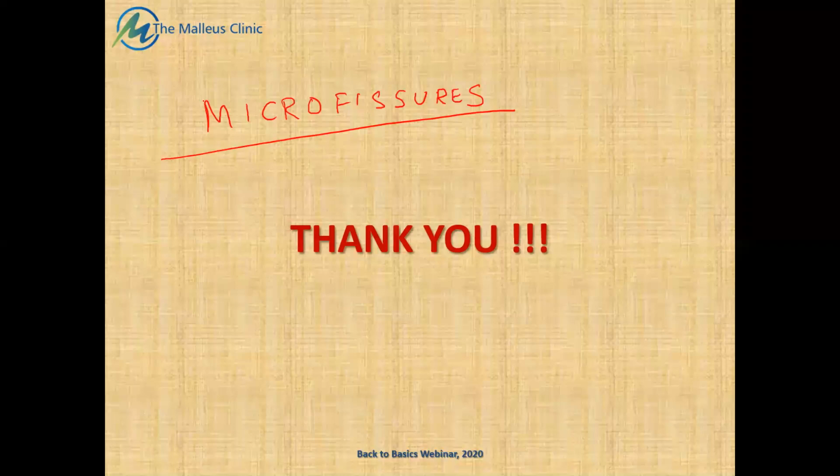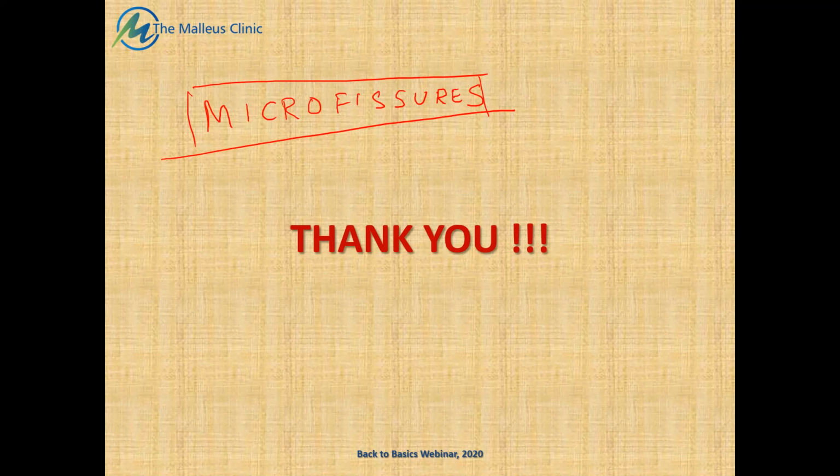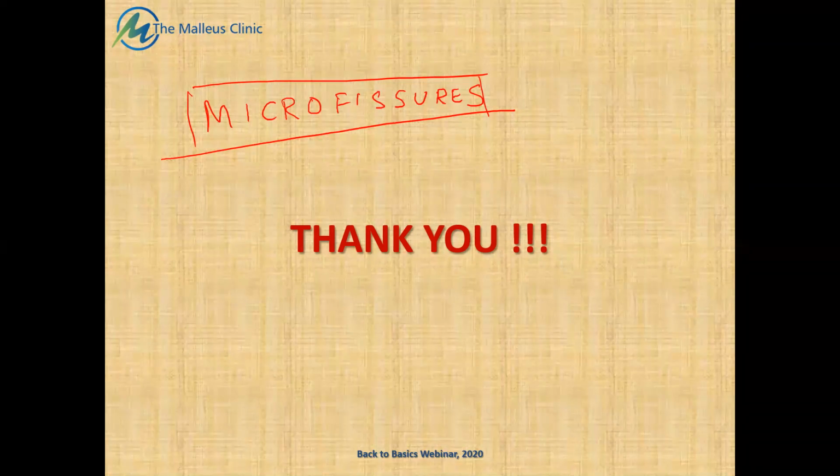The first question I did understand, Professor, and there are cases of microfissures which lead to perilymphatic fistula. Obviously, these patients will be CT negative, and probably some kind of an MR imaging modality would be helpful, and including the gadolinium would be helpful, because it could show us the percolation of the gadolinium from the perilymphatic fistula into the middle ear cavity or the hypotympanic cavity. So I hope that answers your question. But Professor, if you could repeat the second part of your question, please, again.